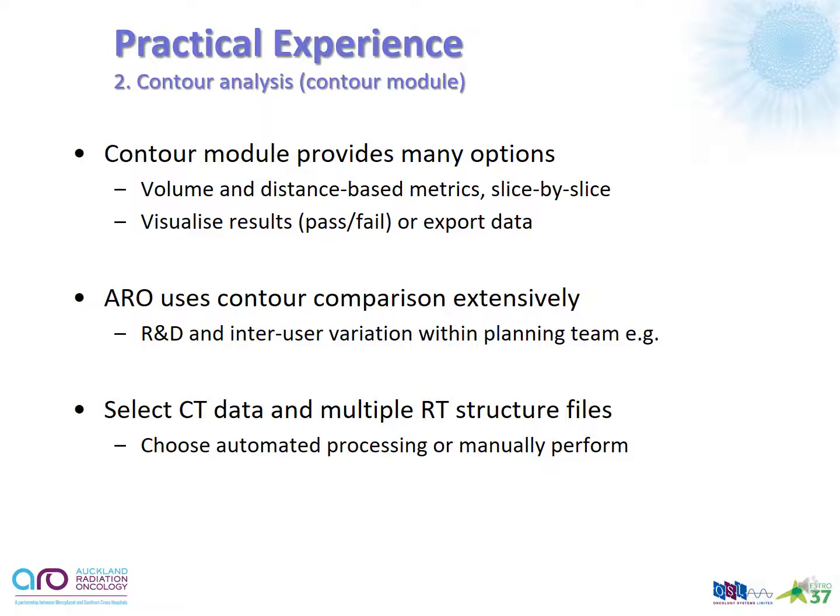Now, we use the contour comparison modules extensively for various research and development projects, and also routine assessment of inter-user variation within the planning team. The process by which you perform contour analysis is incredibly simple. You select the relevant CT data, you select multiple RT structural files, and then you can choose to have automatic processing or perform this manually.